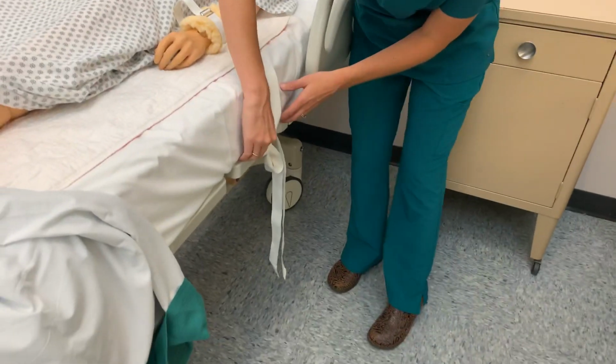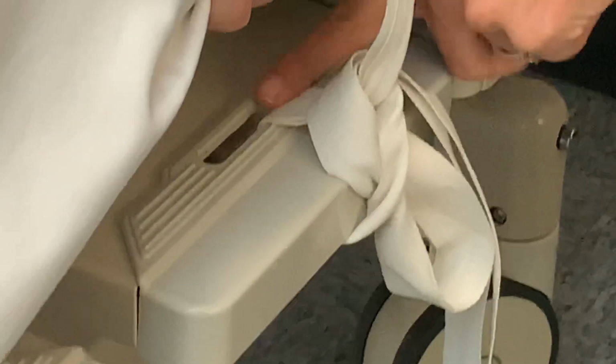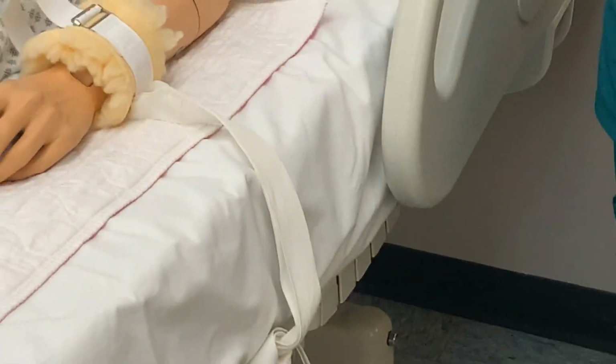I do want you to notice, and I'm going to lift this so you can see, underneath here, this is actually tied to the bed frame. The bed frame is an immovable part. That means a part that does not move on the bed. You always attach or tie a protective device to an immovable part.